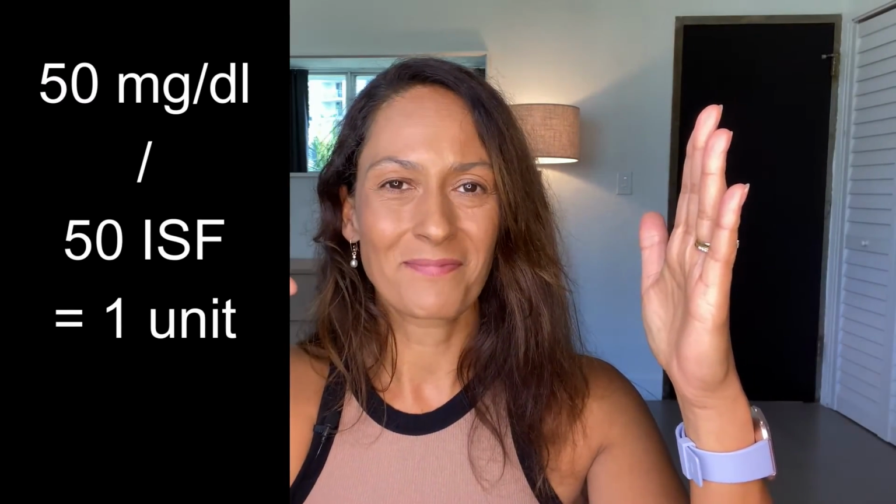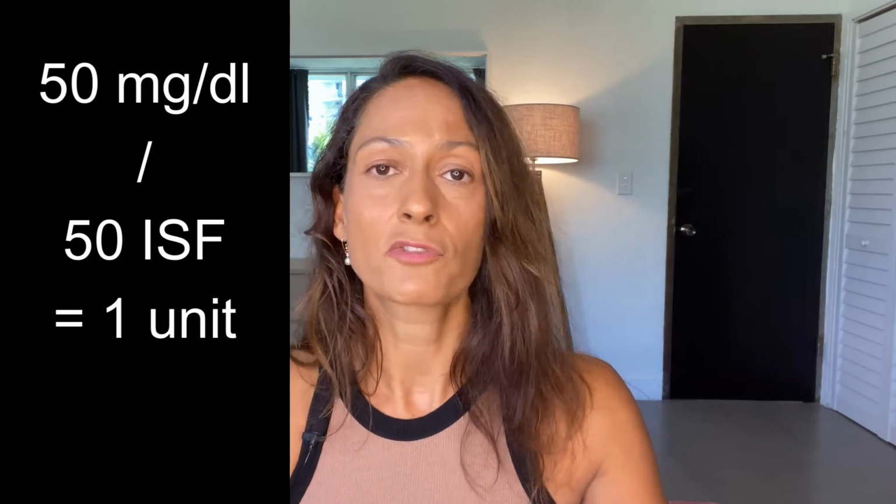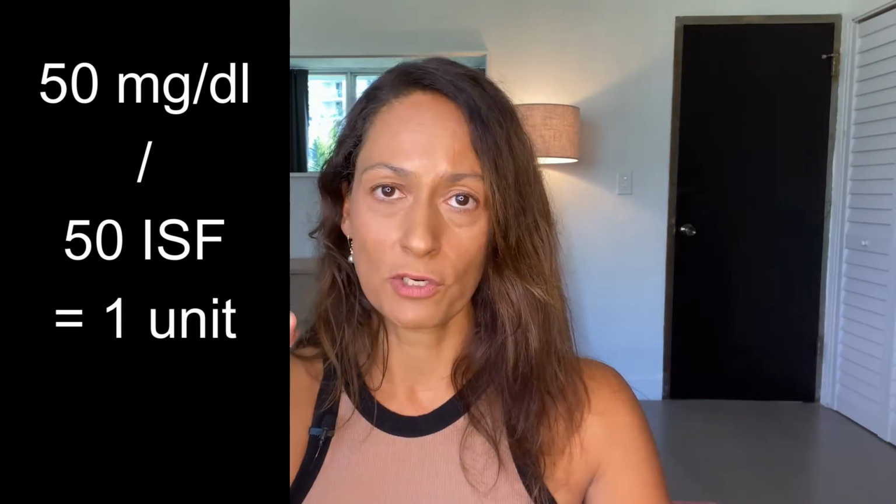Now I then look at my correction factor. My correction factor is 50. That means that 1 unit of rapid-acting insulin, also called mealtime insulin, lowers my blood sugar 50 milligrams per deciliter. So I want to lower my blood sugars down to 100. That's 50. I know that 1 unit of insulin will lower me 50. That means that for correction, just for my current blood sugar, I need 1 unit of insulin.